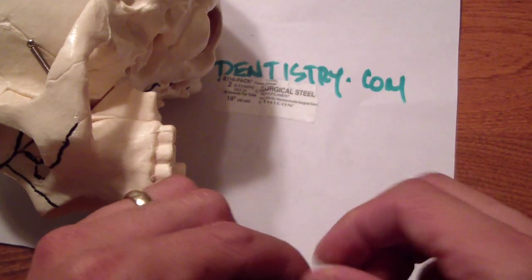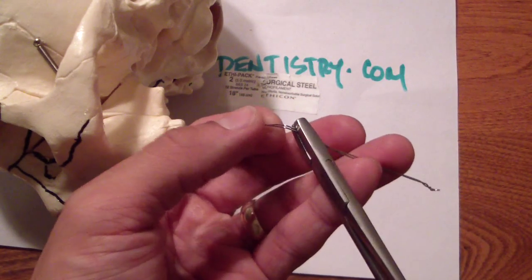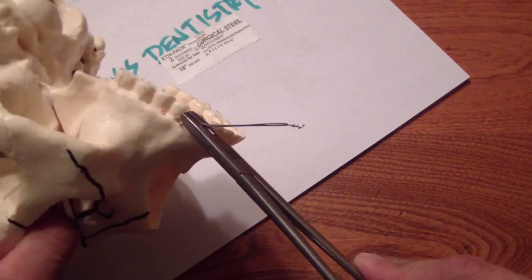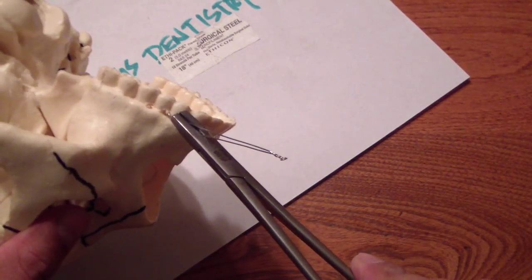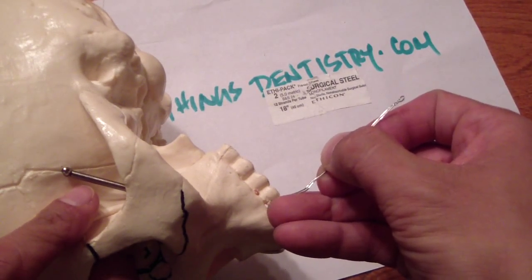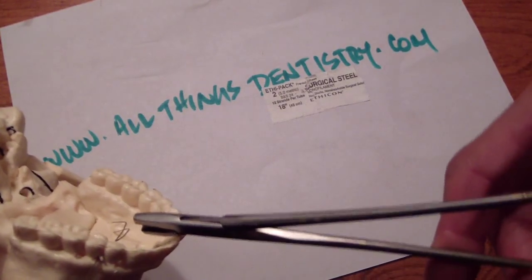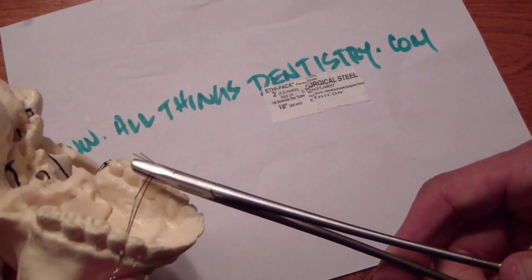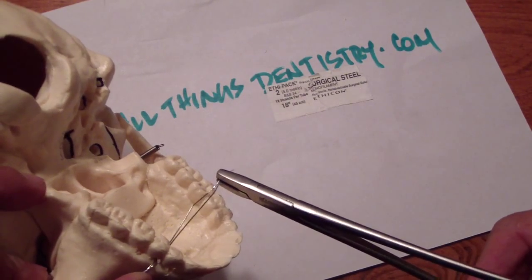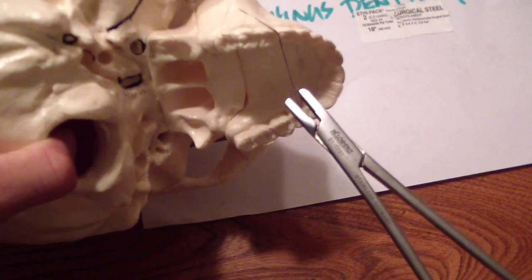So the first thing you're going to do is take your Hager forceps — remember you're going to be going through, just trying to get that through the interproximal space. In this case I've drilled some holes. The patient is going to be laying like this, so you and your assistant or a resident friend push the free ends through below the contact while the other person can pull them.